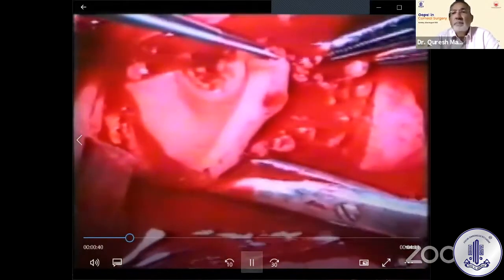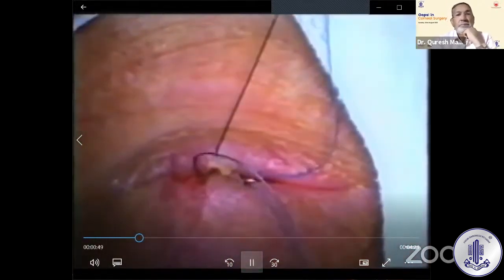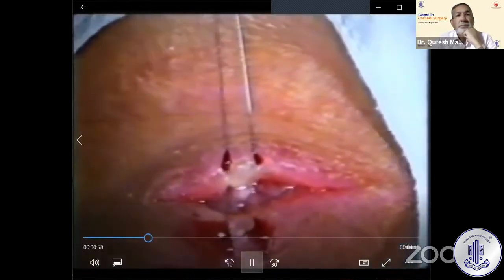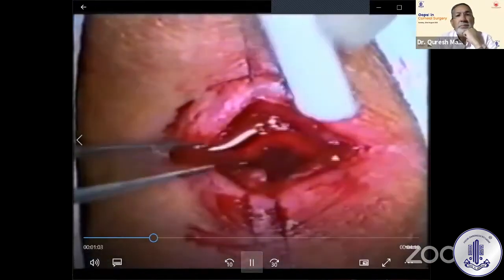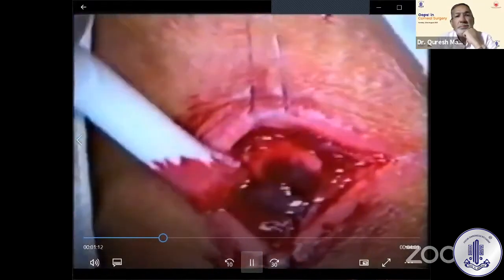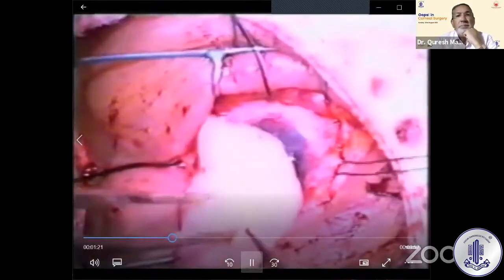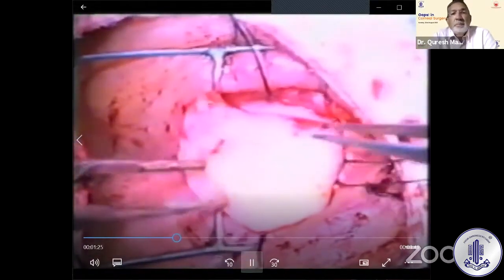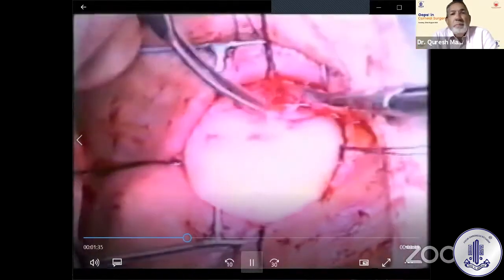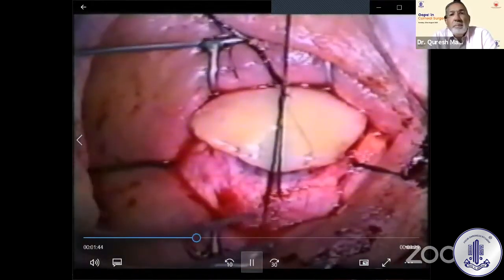Excessive sub-mucosal fat is dissected away with fine scissors. When we expose the eye, two-lid traction sutures are applied. If necessary, palpebral conjunctival plastic procedures must be performed. The conjunctiva and Tenon's capsule are recessed to the rectus muscles. Excessive inflammatory tissue is removed, the corneal epithelium is completely removed, and the oral mucosa is applied on the cornea and sutured with Dexon to the conjunctiva and to the sclera.